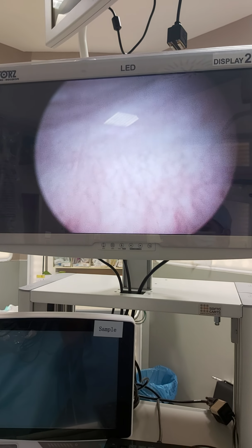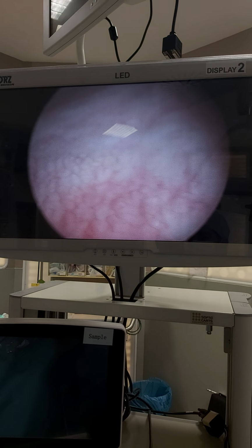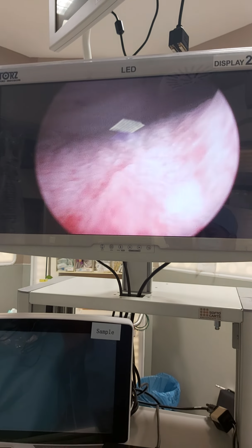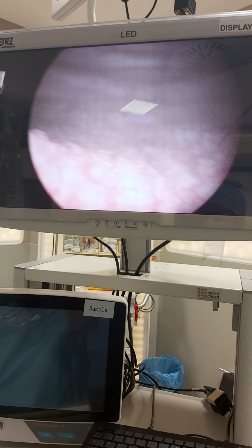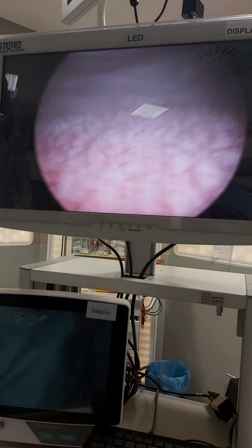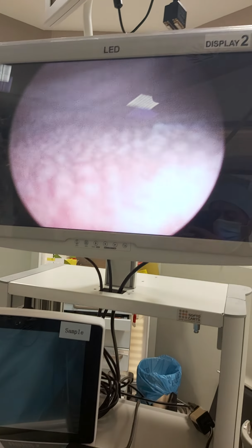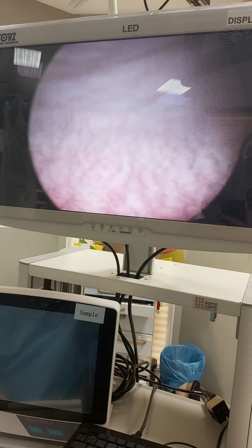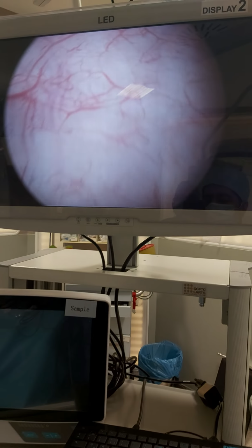I can see it still comes here. These are patchy abnormal areas, and there are some leukoplakia islets, islands, small leukoplakia tissues, but usually it's a trigonitis. We have to say patchy abnormal tissues. These are not normal tissue. What is normal bladder tissue? Normal bladder tissue must be like this.